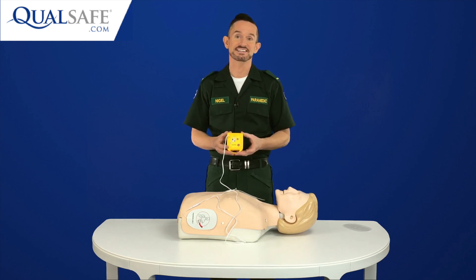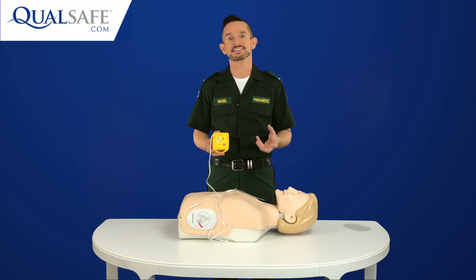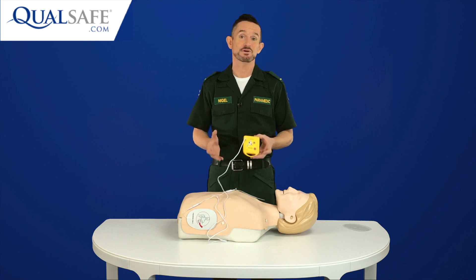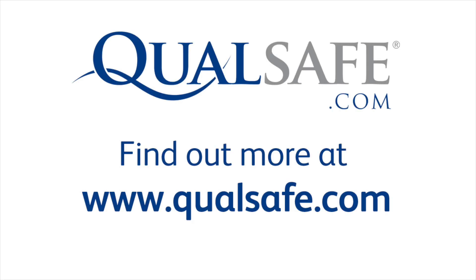So, I hope you like the Mini AED Trainer as much as I do. At last, we have an affordable AED trainer that enables everyone who learns CPR to also practice using an AED. If you'd like more information or to buy the Mini AED Trainer, simply visit qualsafe.com today.